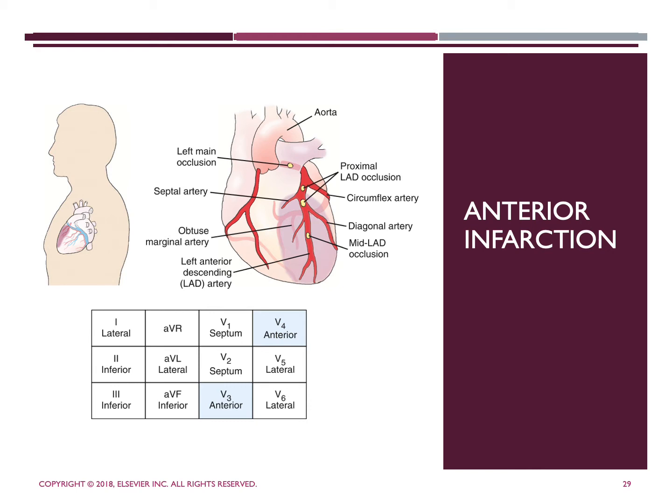Anterior infarction is what we're going to be talking about here, as we look at these figures and pictures on the slide. Occlusion of the mid portion of the left anterior descending artery, also known as the LAD, is going to result in an anterior infarction.